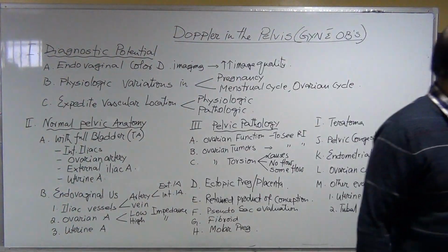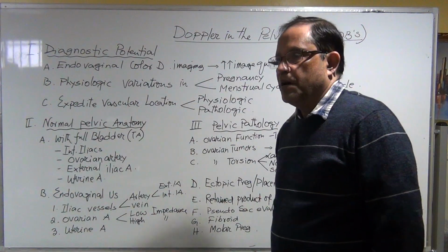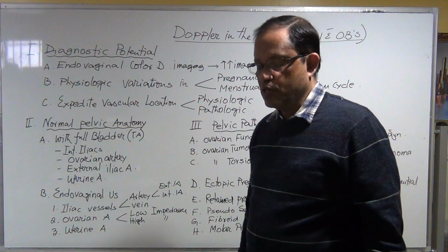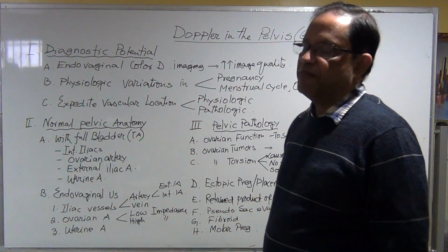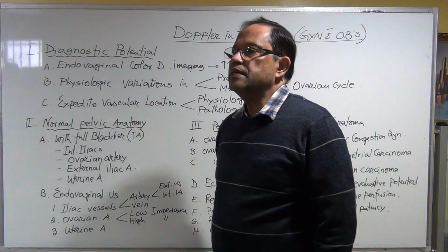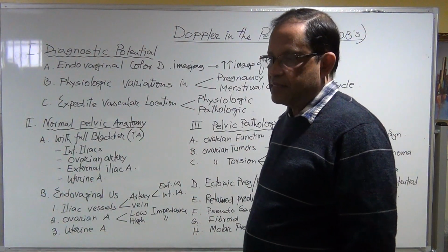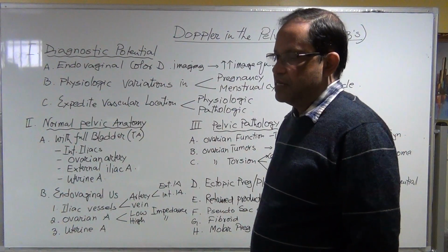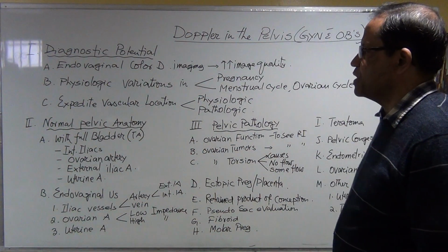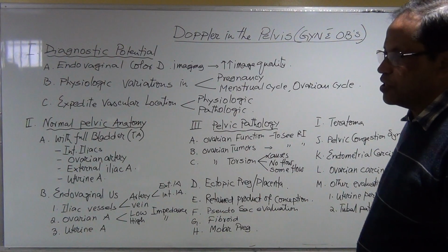And nowadays, for ultrasonography in GYN and also obstetrics, we are practicing trans-abdominal ultrasonography through the full bladder. We also call it transvesical, and there is also endovaginal or internal. The endovaginal approach is much better for GYN practice. And during the first trimester of pregnancy, ultrasonography is such a valuable modality that we can use to diagnose, to evaluate and to follow up the condition of a patient.